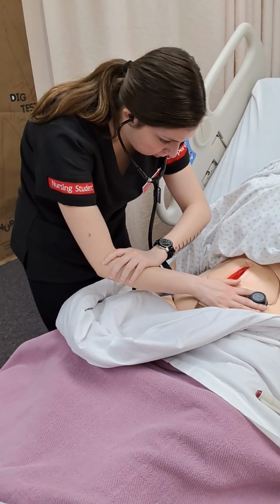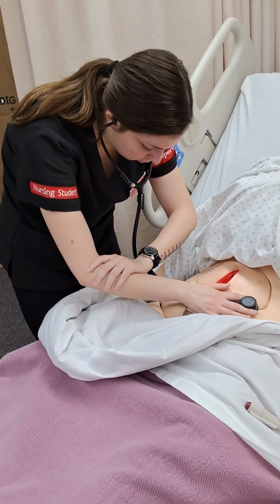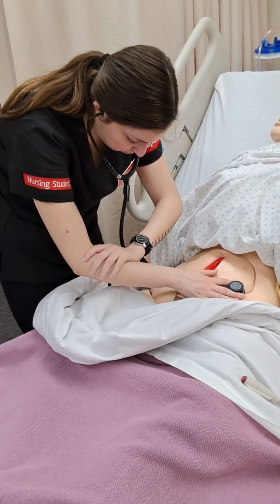So I don't hear any bowel sounds, so I'm going to listen to the left lower quadrant for 2 extra minutes.